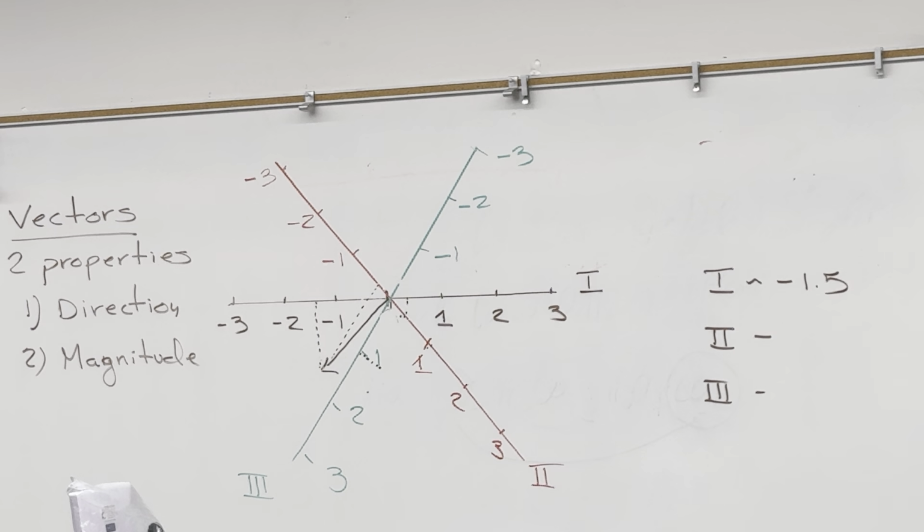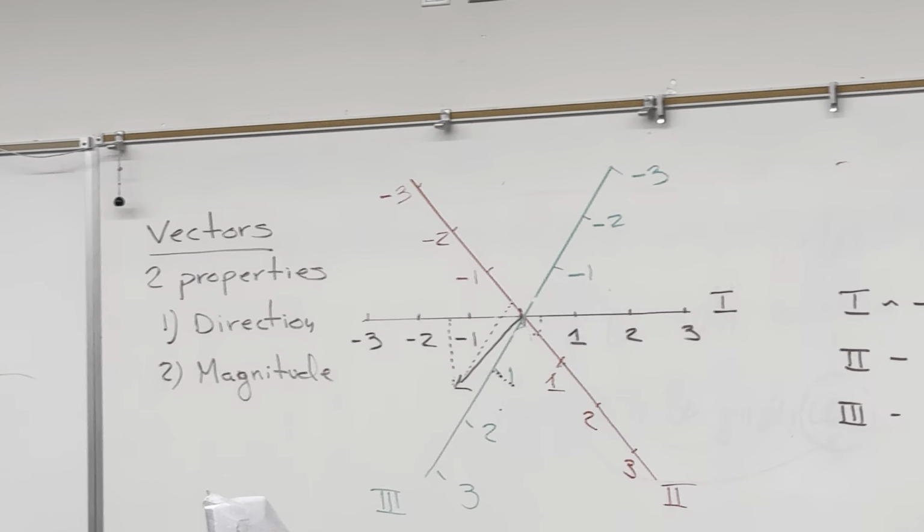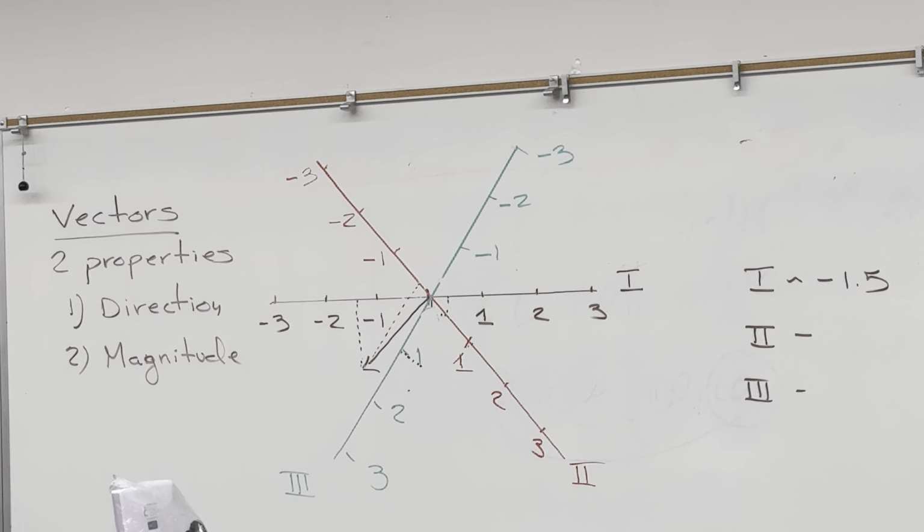All right, so tonight you're going to be working with the iWork system again. We're going to use the approach that you used when you were recording the EMG of the calf muscle. So you've got your magic little black box. You're going to get what I call the patient cable.